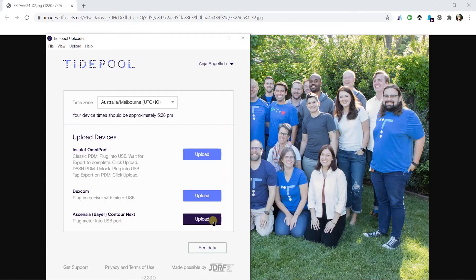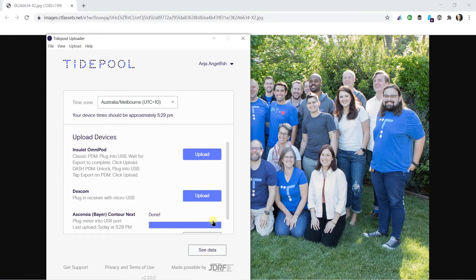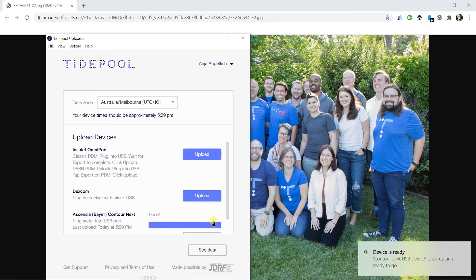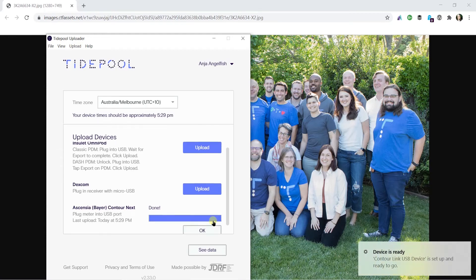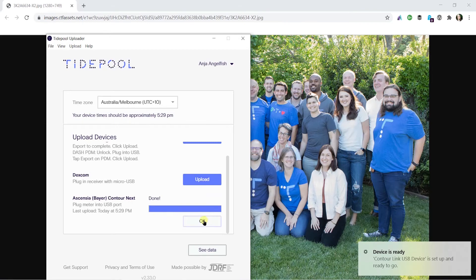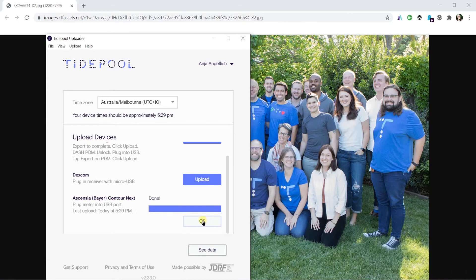Please note, the first time you're uploading your device data with Tidepool will likely take longer than future uploads as our software will have more data to read. That's it!